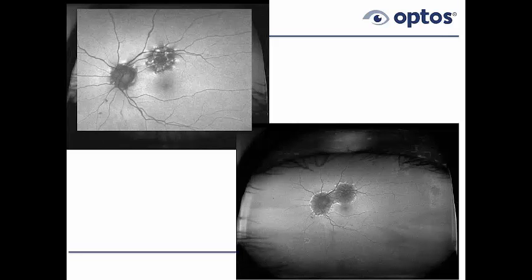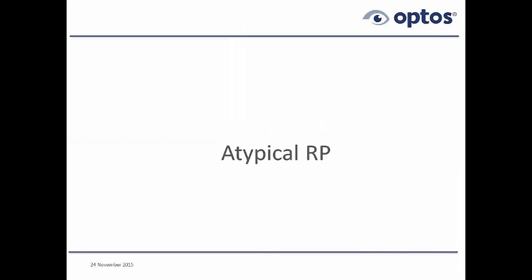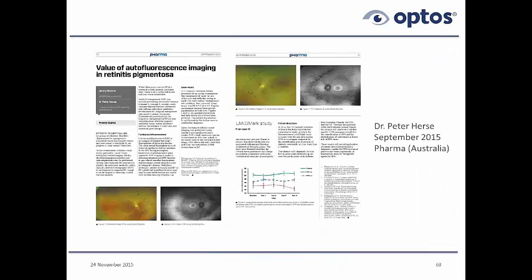Again, it's related to the cumulative dosage, that's one factor, and the number of years you've been on. On that last case, you mentioned just now that there were cataracts involved as well. And how much do cataracts actually impact the quality of the FAF imaging?